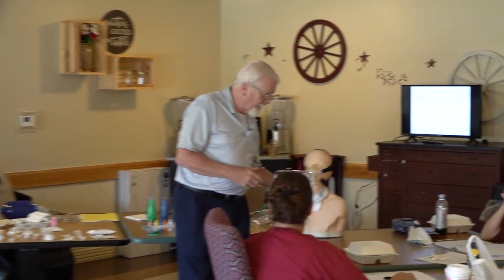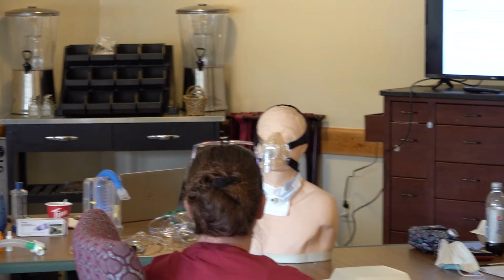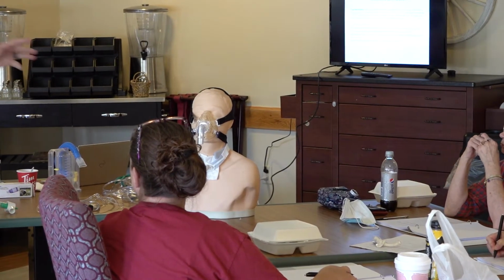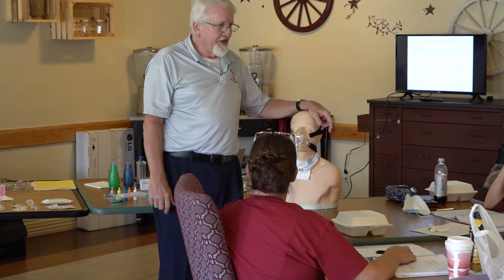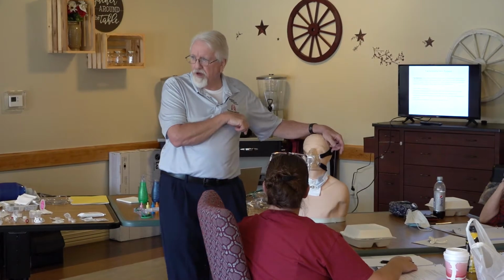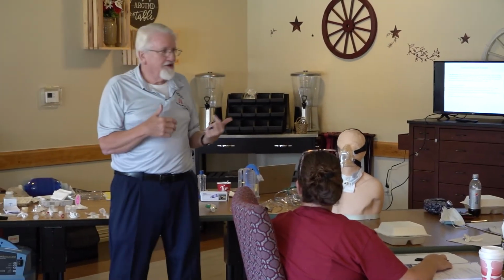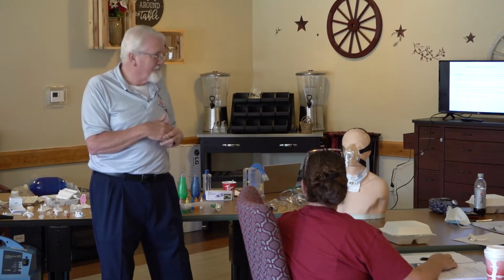So starting from scratch for Trach Care, you need to make sure the order sets are in your chart for Trach Care per protocol, what have you. A big thing to remember on your orders is, if Bob's been here for a year and you were on vacation for a week and you come back and they say, oh, guess what, Bob was sent out to the hospital last week while you were gone. When you send a trach patient out, or probably any patient, I'm just familiar with trach patients, and they come back, you lose some of the order sets. It's inevitable. They don't all get brought right back in.